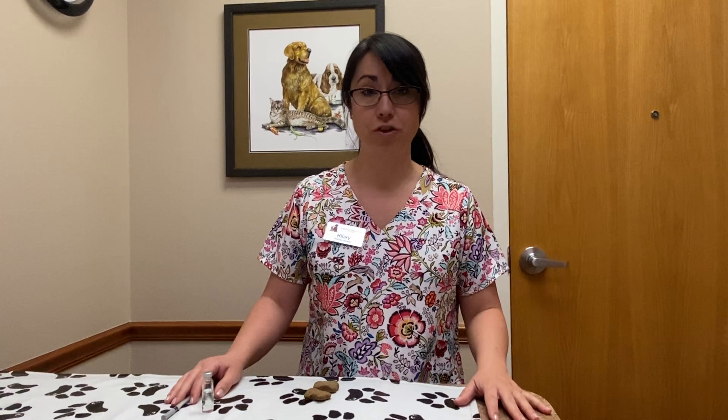Hi, my name is Hillary. I'm one of the veterinary technicians at the Veterinary Dermatology Center. Hopefully you've already watched the video on the allergy vaccine schedule. Now I'm going to show you how to draw up the vaccine and administer it.